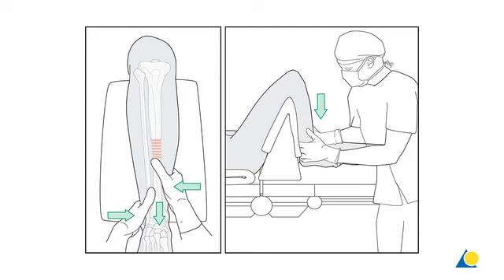Reduction is usually more challenging with proximal and distal fractures as well as with cases of delayed treatment. Sometimes only mild traction and rotational adjustment are required. Percutaneous reduction aids such as pointed reduction forceps, Schunz screws, or a ball spike pusher may allow reduction without opening the fracture. With other fractures, open reduction may be necessary.